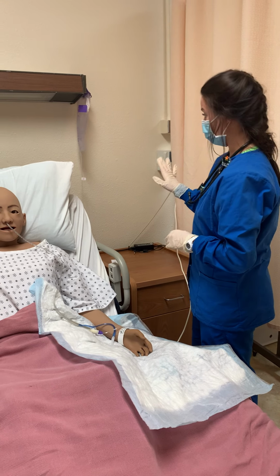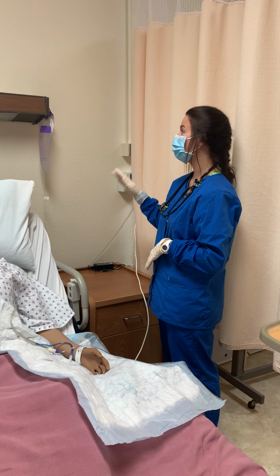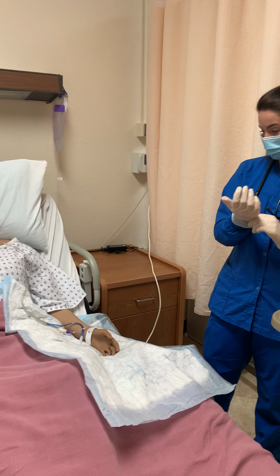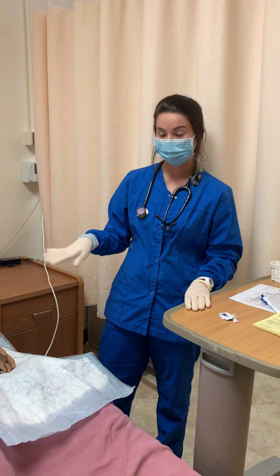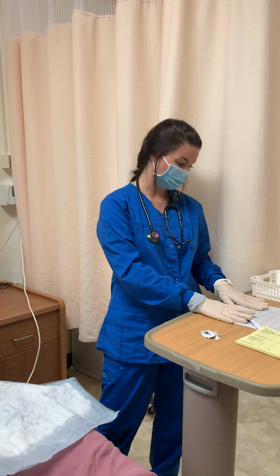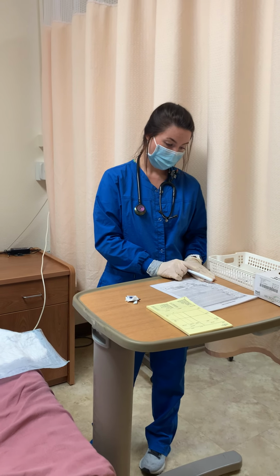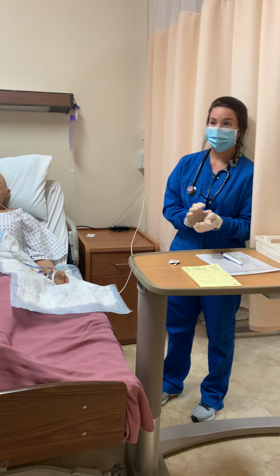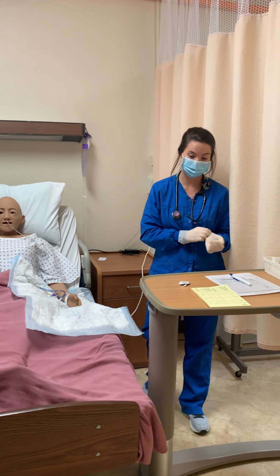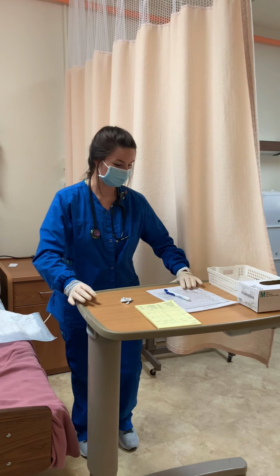So you would just unhook this, hook your feeding up to Miss Joanne here. And then you would just press start to make sure that it was set to your 40 mils an hour like Jeff had prescribed, and then you're good to go and you can hit start. And then the other thing too is you would want to check every 4 hours for her residual, and then document this. So you would want to make sure you go to your documentation and mark off that you gave her Jevity and her Lovenox. And then at the end of your shift as well, you want to mark your bag with your initials and everything so that the next shift knew where your feed was left off.